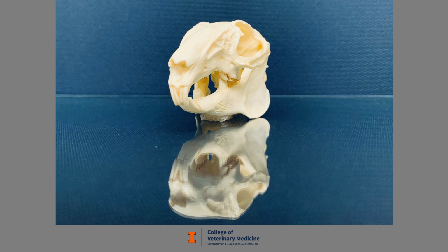First, I will briefly review the basics of this procedure with a rabbit skull. Two standard radiograph positions are used, a right or left lateral and a dorsal-ventral view. Oblique lateral and rostral-caudal radiograph views may also be useful to evaluate rabbits with dental disease, but are not covered in this video as objective assessment lines are not described for these views.